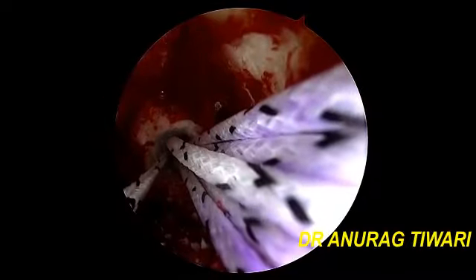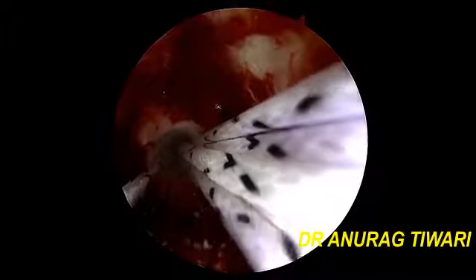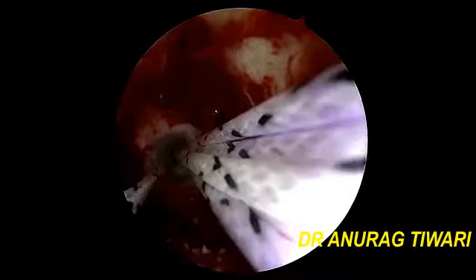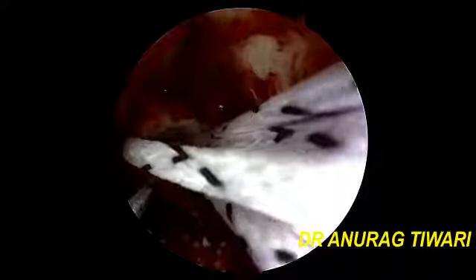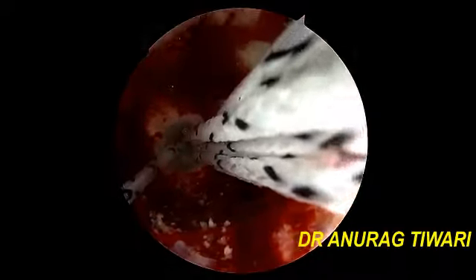So the flipping has been done. It has been adequately flipped. When you pull now the graft, the button will not come out. It has been flipped and is fixed onto the lateral femoral condyle cortex, the outer cortex.